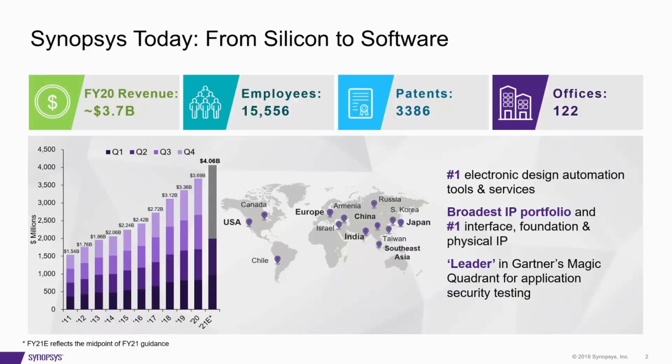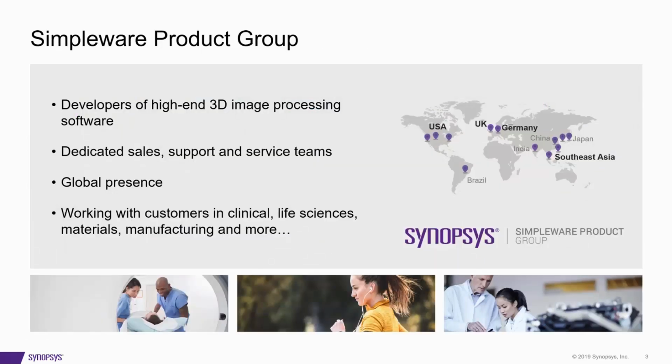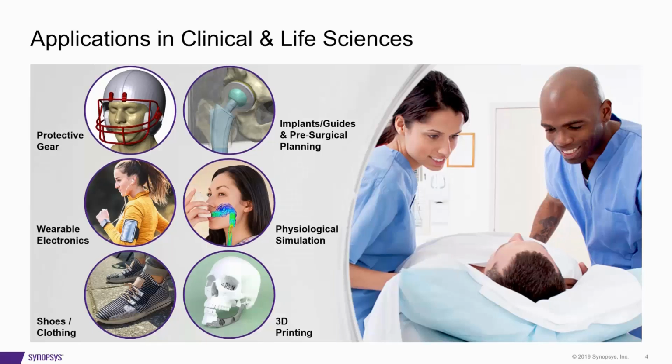Now, Synopsys is a global company with interests in a range of software, amongst other solutions. Synopsys is now over 15,000 people spread across the globe in over 120 offices. I work for the Simpleware product group, and we develop and sell 3D image processing software and services. And we work with customers in a range of industries, including clinical and life sciences. Within the clinical and life sciences arena, we cover areas from patient-specific implants to wearable electronics, and you can see some examples here on the screen.